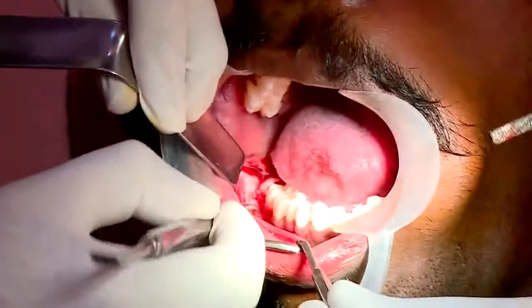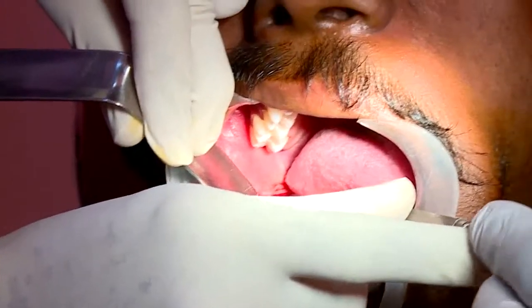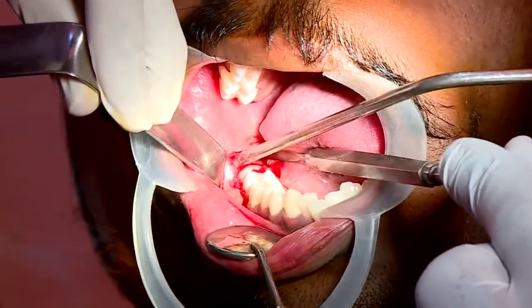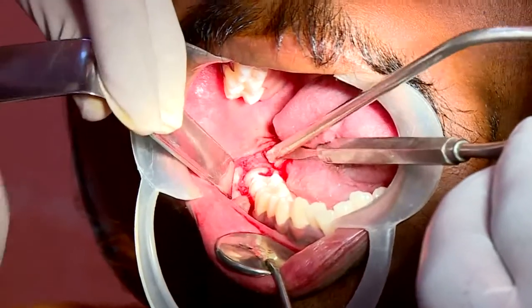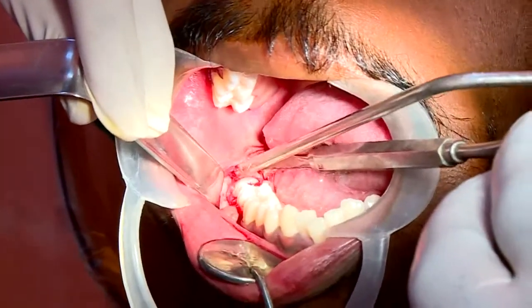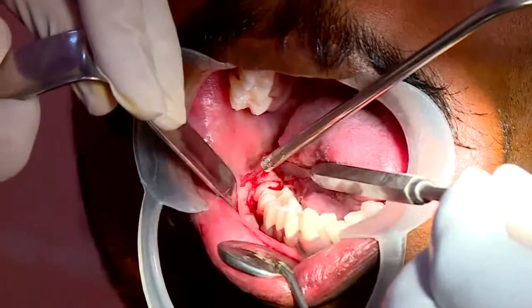After this, is reflecting the entire tissue, so the distal surface of the bone, what is distal to the tooth, is seen. And you can then protect the lingual nerve. The lingual nerve is very close to the third molar. In class 2, class 3, there is a high chance that the lingual nerve can get affected. So you have to be careful and always use an instrument to protect the lingual nerve.